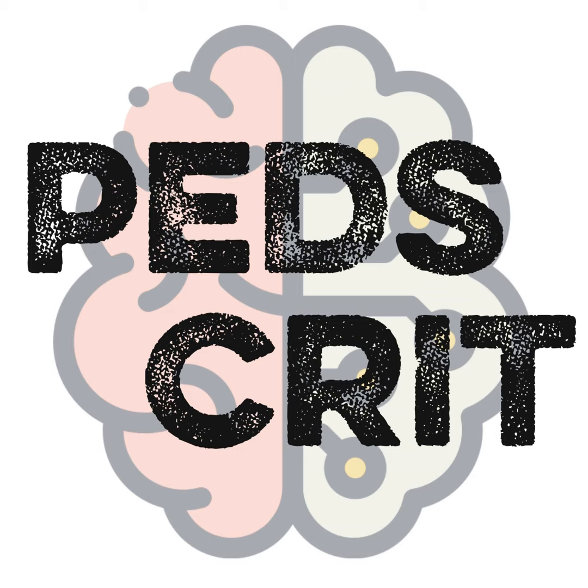Everything you're saying makes perfect sense. When you cannulate for VA-ECMO, you're essentially taking over cardiac output for that patient. So you want to make sure the lactate is going down, the NIRS are going up, kidney function, liver function, everything is improving. One clarifying question for me and other people who aren't as experienced. When that ECMO specialist is asking you, Priya, where do you want me to start out with flows? What's a good rule of thumb for maybe an adolescent patient, whether it's a cardiac index or mLs per kilo? What do you usually say?